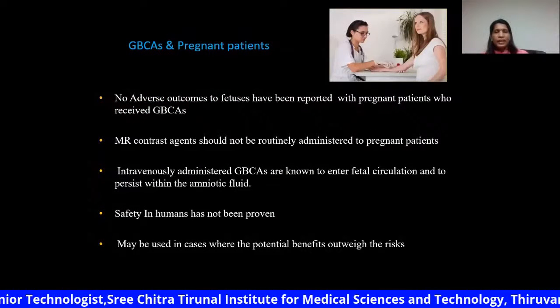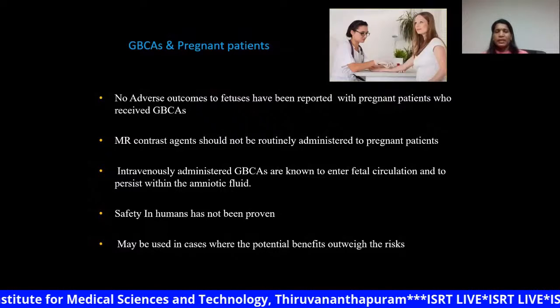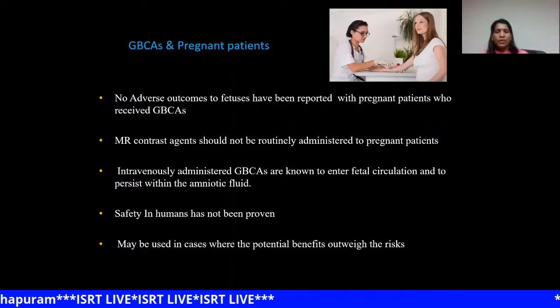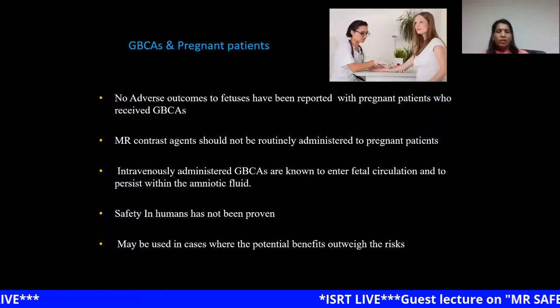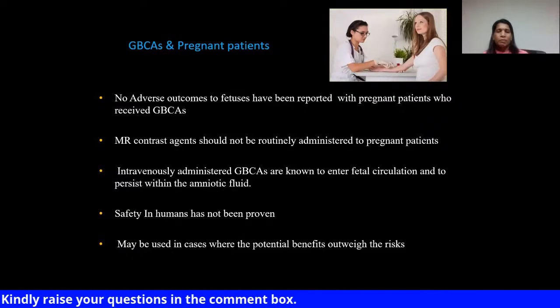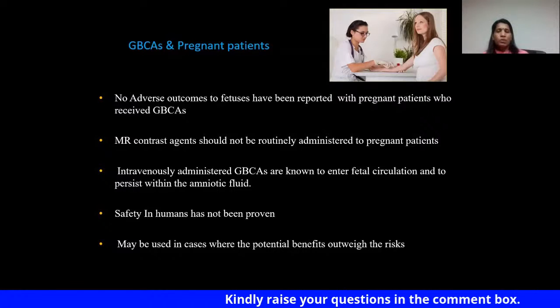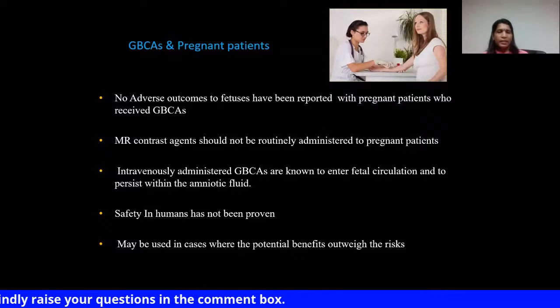Then also, whether we can give gadolinium contrast to the pregnant patient. That is another concern, because in animal studies, gadolinium contrast agents have been shown to cross the placenta and remain in the amniotic fluid for a long period of time. No adverse effect has been reported in the fetus of mothers who have received gadolinium-based contrast agents during their pregnancy.